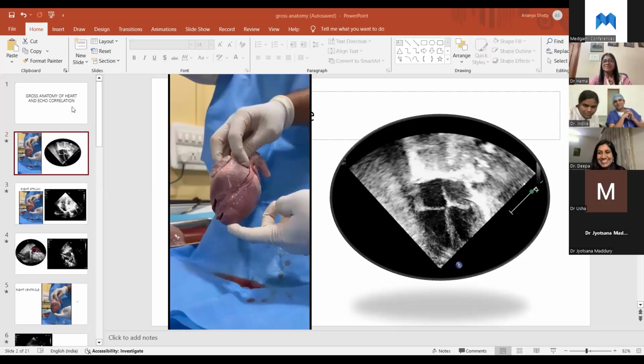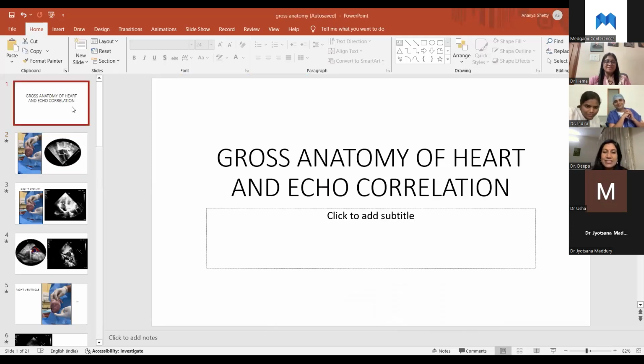Yeah, audible, Deepa. I just wanted to ask one question before we start. Do you find pulmonary vein injuries when we've done a RUPV approach? We try to put a device through the right upper pulmonary vein, we don't succeed, and we send for surgery. Do you find RUPV or LUPV injuries during surgery? I've taken out one device.